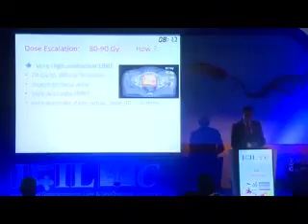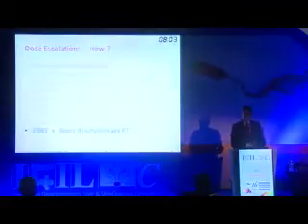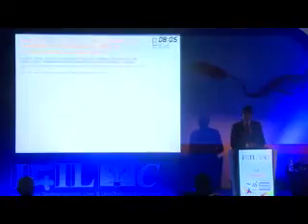The second methodology to dose escalate is that you give the prostate the external beam radiation for 50 grays, and you boost by brachytherapy if this facility is available.